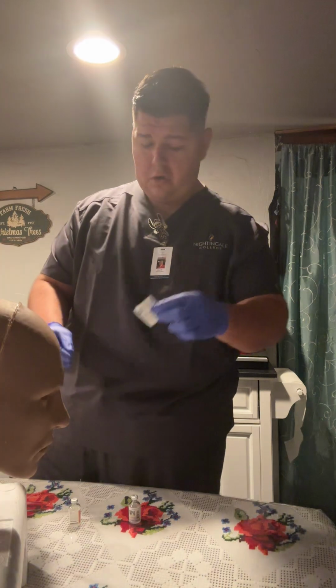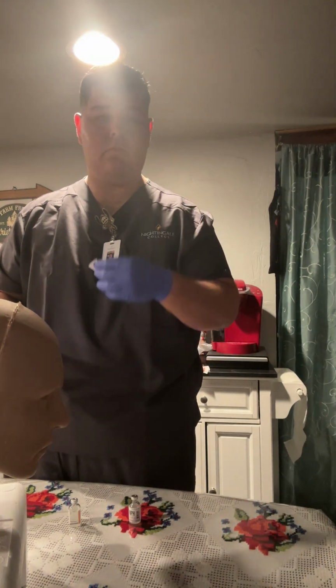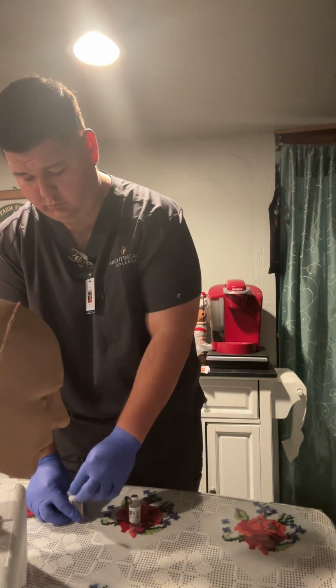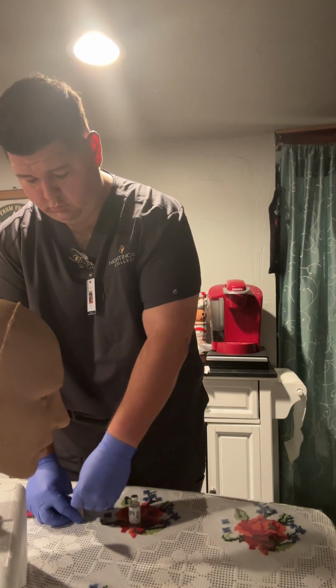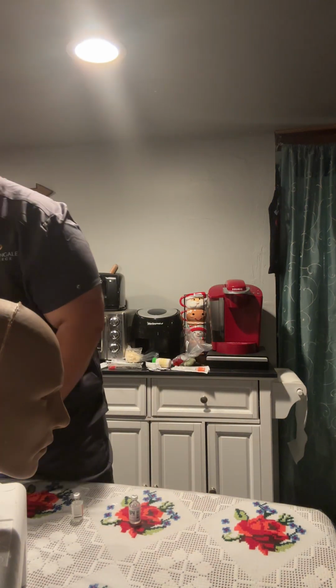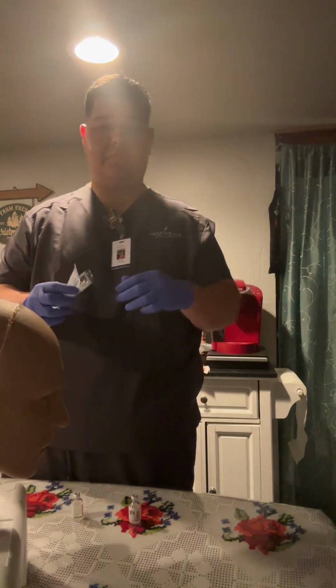I'll take a second alcohol prep pad and clean the top of the vial. Okay, then I will remove my needle and the syringe from the plastic.